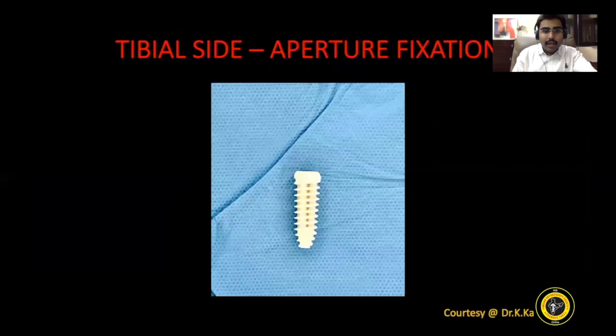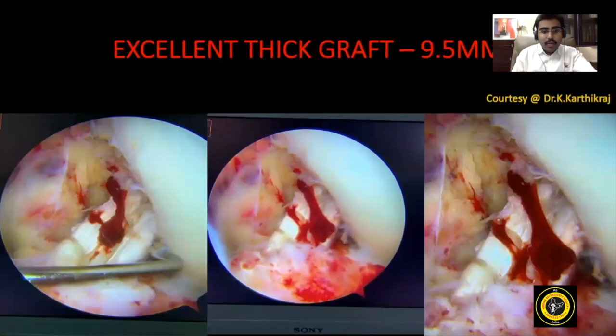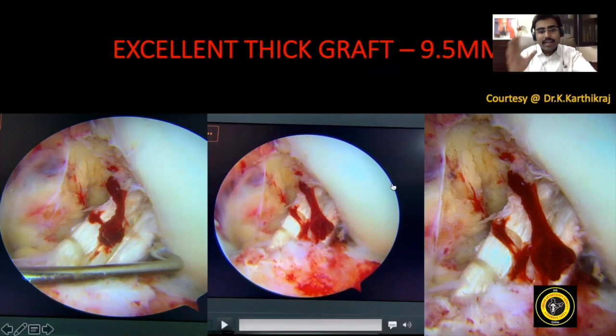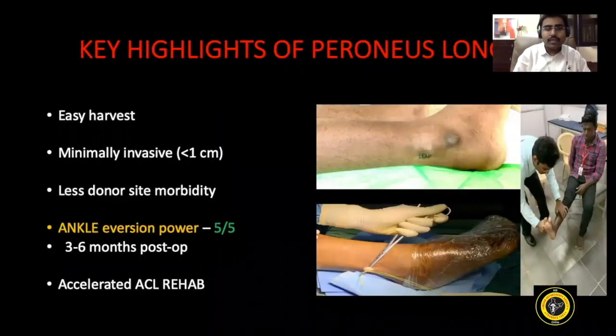On the tibial side, yes, I love aperture fixation with the bioabsorbable screw or anything of the surgeon's preference. Now, this is the end of the graft that has been put back after using the Peroneus. You can see the nice, bulky, flush graft, which is a 9.5 mm graft in place. So I always fall in love with this kind of view after Peroneus longus graft. Now that's the end of the surgical technique. Let's quickly go on to the highlights.